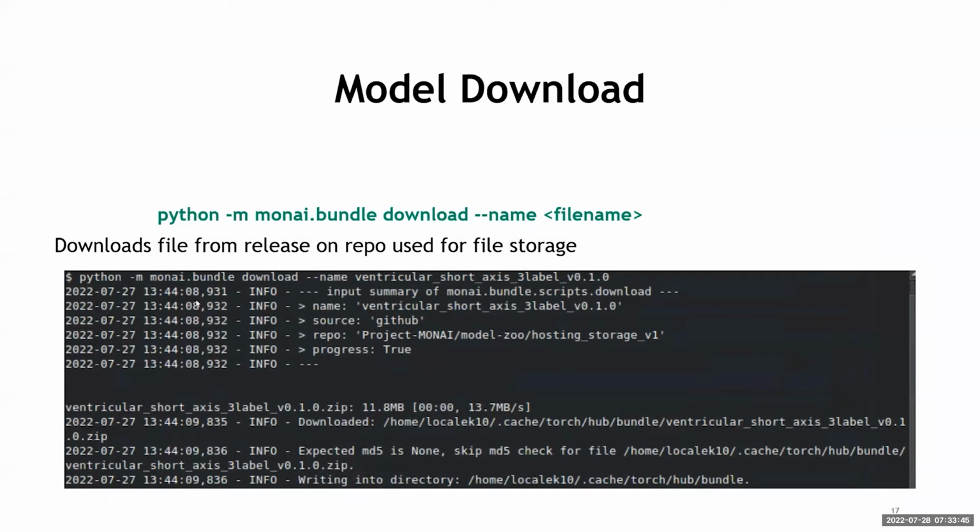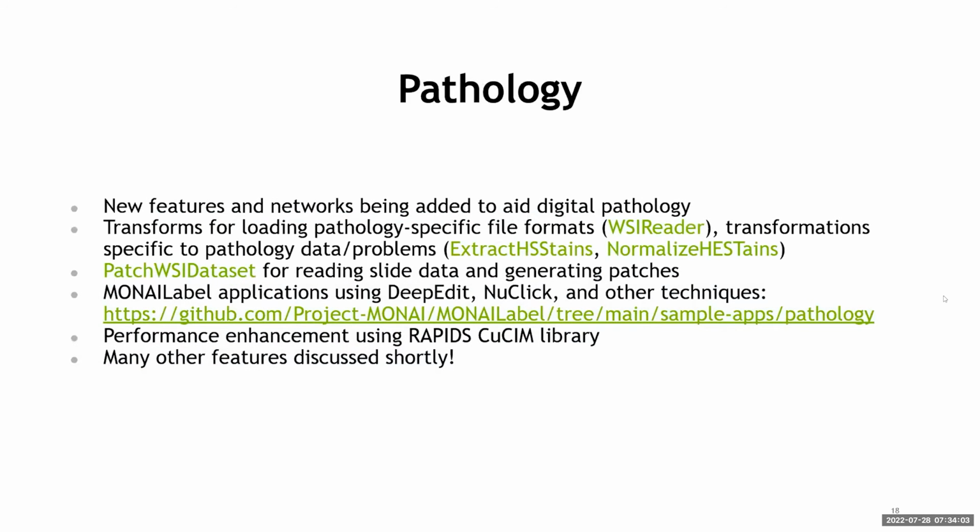And we can have an example here of downloading this very model by version name, and this will automatically pull it down to a known local location, and then other software can use that bundle once it's downloaded. So these slides will be shared, as I say, so you don't have to worry about inspecting that too closely.